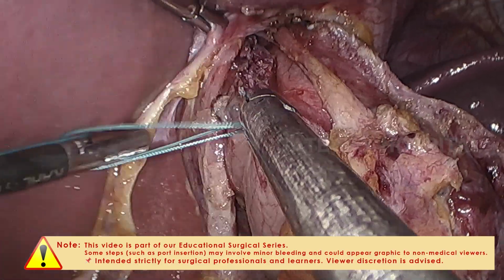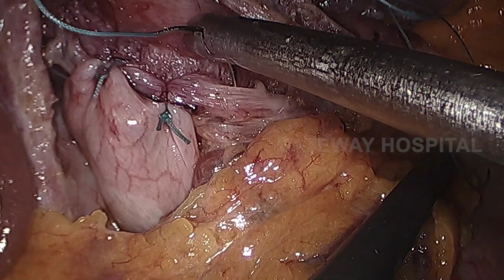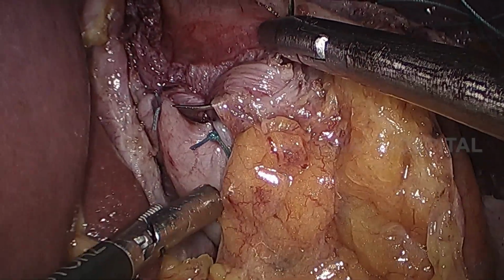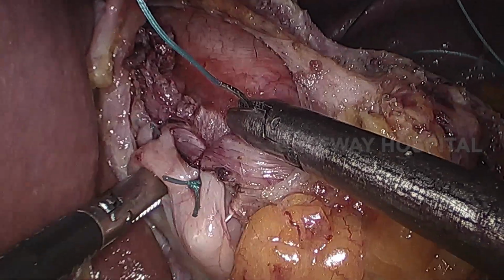You can appreciate while doing this Toupet fundoplication, the vagus is running anteriorly over the mucosa.